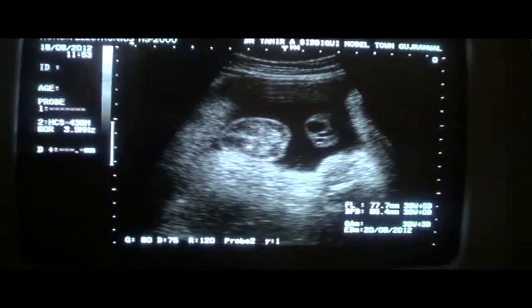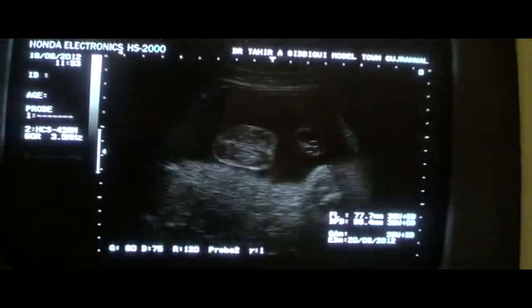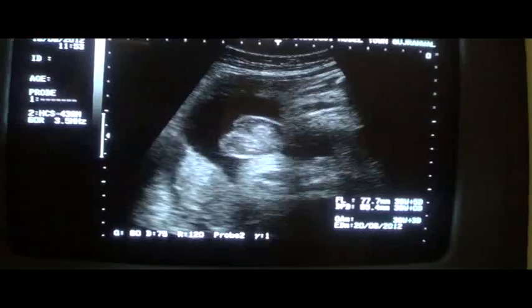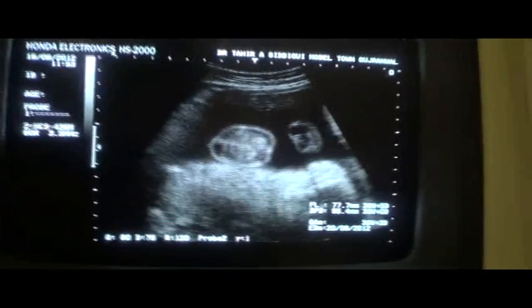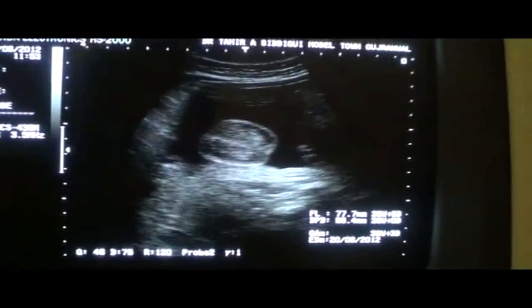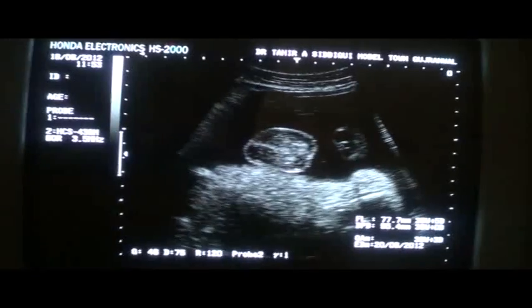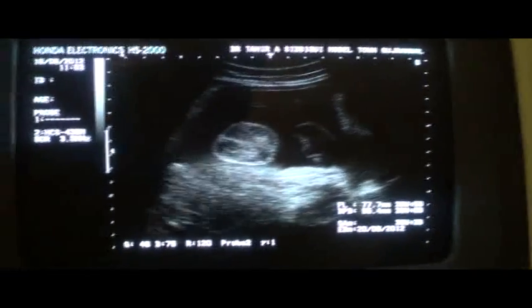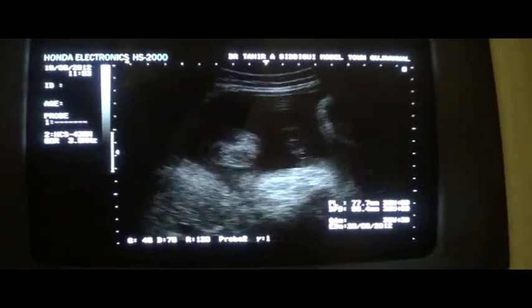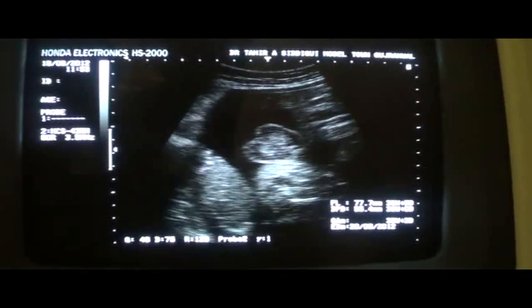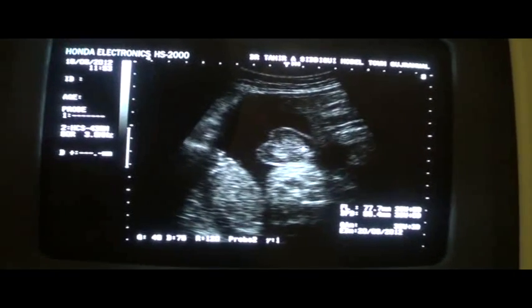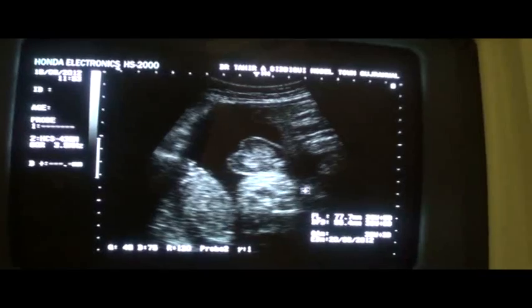This is the scrotal sac, and these are the testes in between. You can see the scrotal sac with testes seen beautifully within the scrotum of the fetus. At times you get the sex of the fetus from this area — this is the scrotal sac and these are the testes of the fetus.